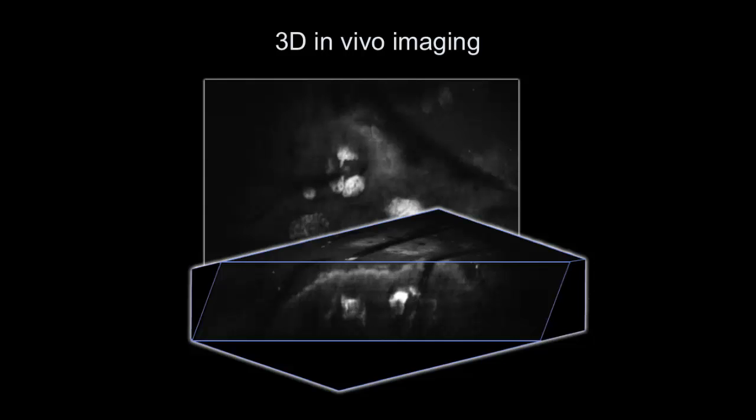So these structures, which are about 60 microns in size, give you a lot of signal and can be intercepted at video rate because the light is traveling into the tissue but is then scattered back out, and that's what we detect. Again, if it wasn't for this effect, there's no way we could have done video rate imaging in a living animal.